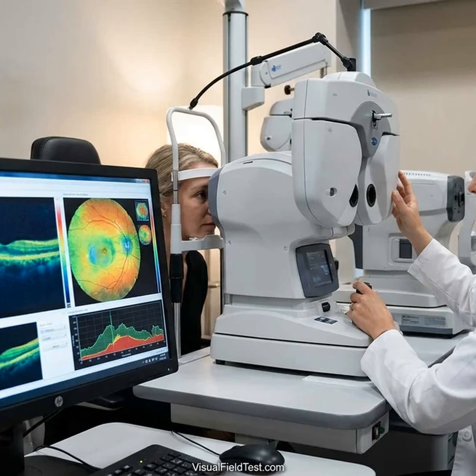A study noted, for example, that an OCT outside normal result may still be a false alarm if not confirmed by examination or fields. Likewise, mild visual field loss can occur even with relatively normal scans if the disease is at a stage where OCT is limited. In practice, your doctor will ask, "Do my findings make sense together?" If all tests agree on progression, they will act. If tests conflict, they might repeat testing or choose the most reliable result, often the visual field in advanced disease or OCT in early cases.